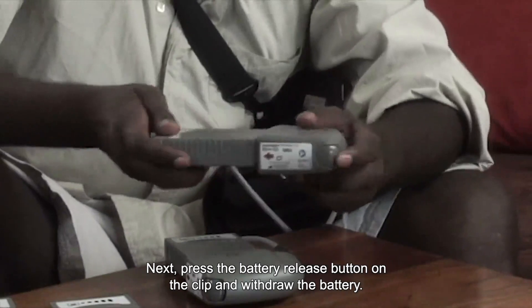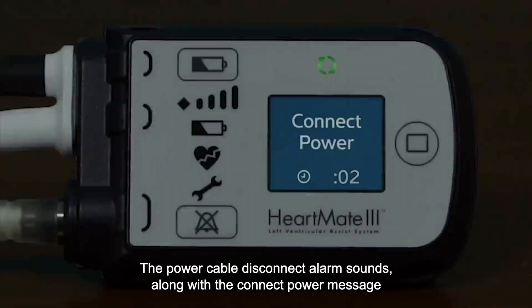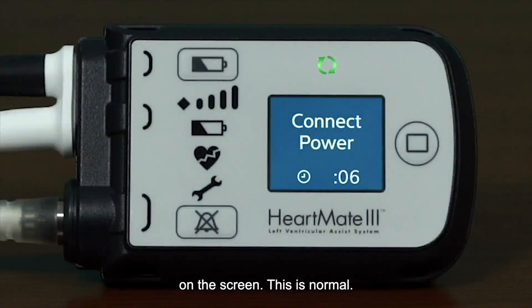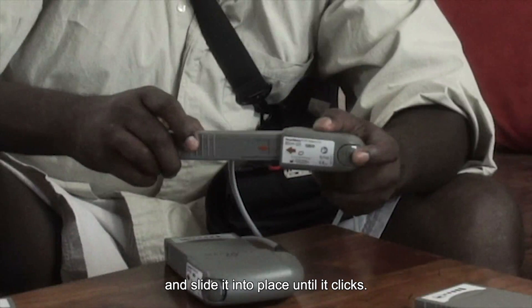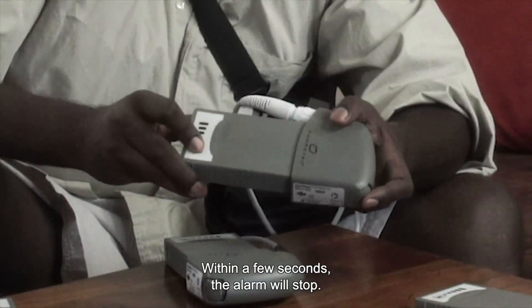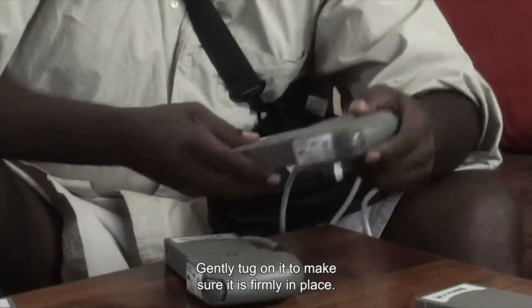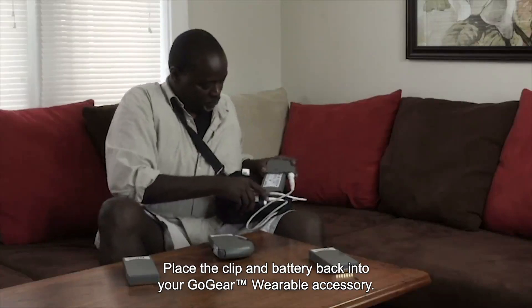Next, press the battery release button on the clip and withdraw the battery. The power cable disconnect alarm sounds along with a connect power message on the screen — this is normal. Take the new battery, line up its arrow with the arrow on the battery clip, and slide it into place until it clicks. Within a few seconds, the alarm will stop. Gently tug on it to make sure it is firmly in place, then place the clip and battery back into your GoGear wearable accessory.